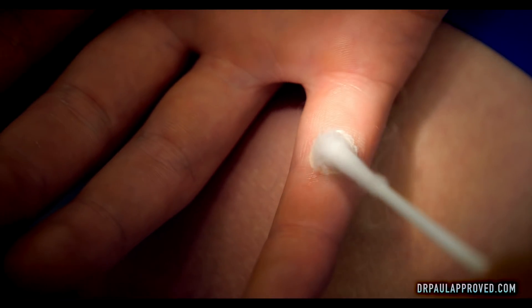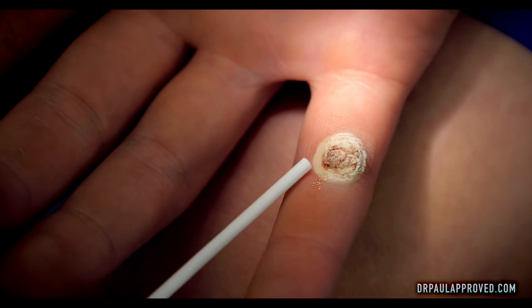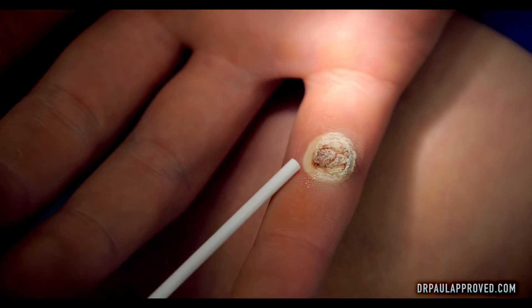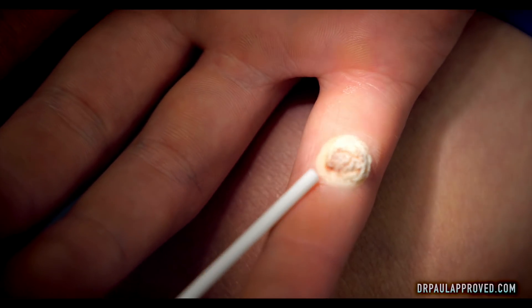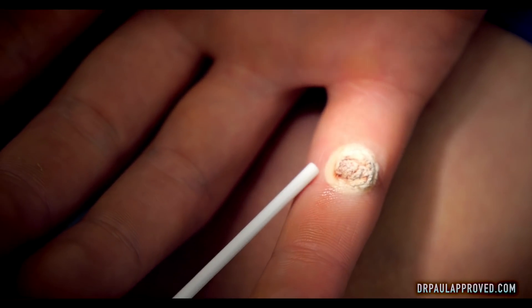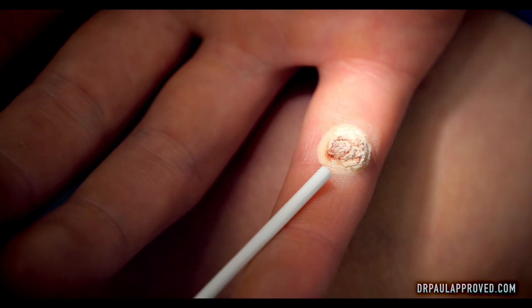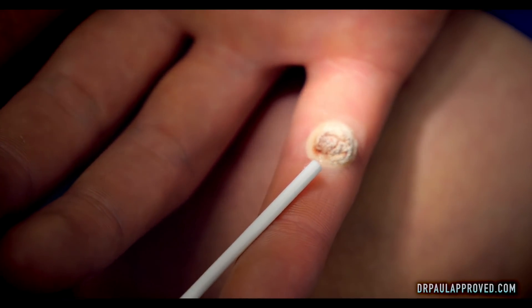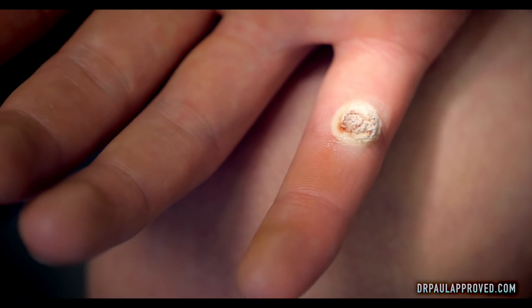That is a nice freeze. Occasionally when you do a deep freeze like this, the area that's frozen of normal tissue could actually get a blood blister. Don't panic if that happens — that actually is almost a good thing. The warts almost always fall off if you get a blood blister. The area that's frozen white here will turn pink after it thaws, and hopefully within the next month that'll just drop off.